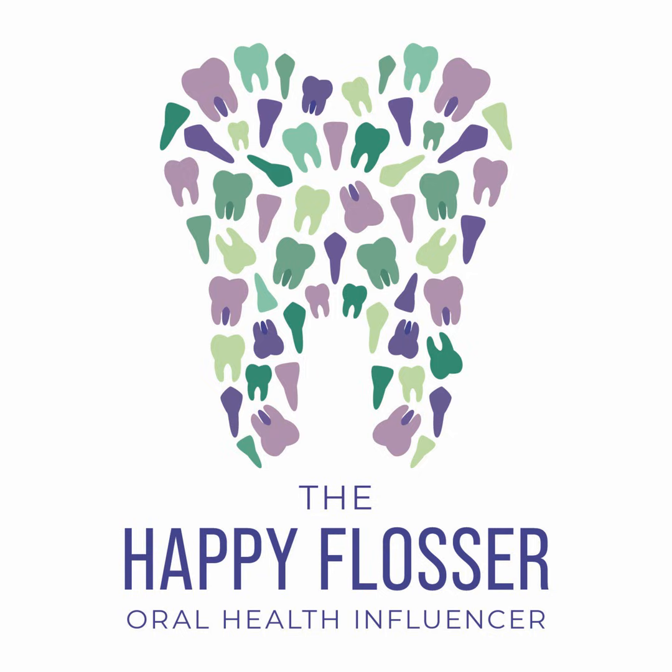One last suggestion I'll just provide you is that we get highly skilled with practiced and continued evaluation. Self-evaluation of our radiographs throughout the entire process when we are taking these images is key. So I don't want you to overlook that fact. It is so important for you to continually be evaluating, self-evaluate each image that you take. Don't just trot along and continue taking those images on your patient. Look and see, do I need to change my angulation? Do I need to change my sensor placement? Do I need to make any kind of adjustments that will make it so that the next image I take is high quality?